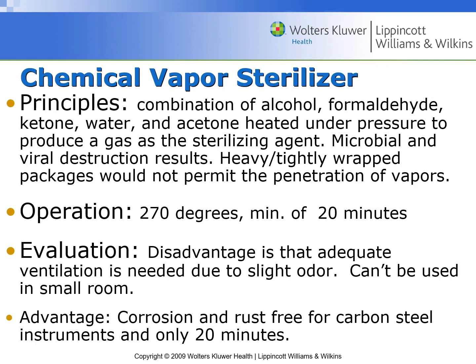Heavy, tightly wrapped packages would not really be able to permit the penetration of vapors, so it would not be good for our tightly wrapped cassettes. It needs to go up to at least 270 degrees for a minimum of 20 minutes. Disadvantage is that you need to have adequate ventilation because there is a slight odor and it's not a good one. It cannot be used in a small room because of the odor. The advantage is that there's no corrosion and it's completely rust-free for carbon steel instruments, and it only takes 20 minutes. But no one can really use this because you'd have to have a larger facility than most dental offices, with such a great ventilation system, that it makes it undesirable for offices to have, so they usually opt for the steam under pressure.